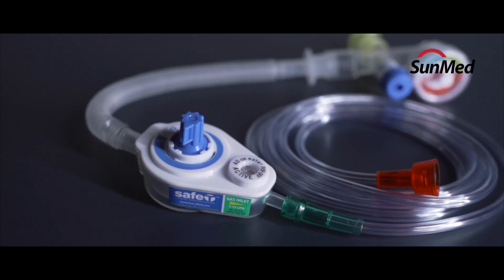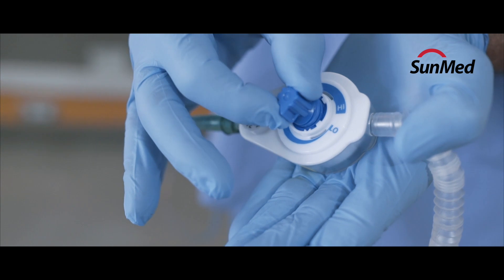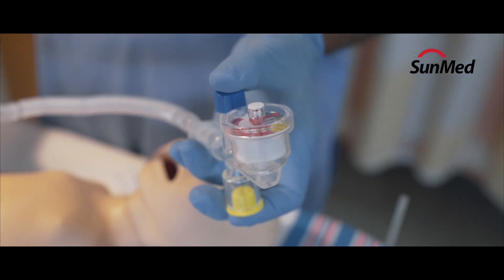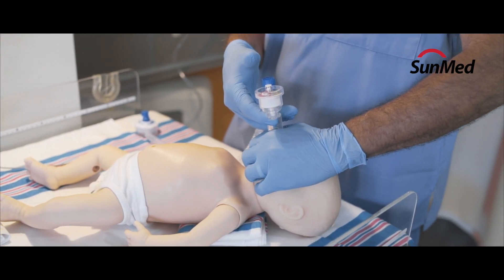Unlike a self-inflating BVM or hyperinflation system, the PIP pressure on the Safe-Tee can be preset prior to use, and the device does not require hand compressions to deliver the breath.